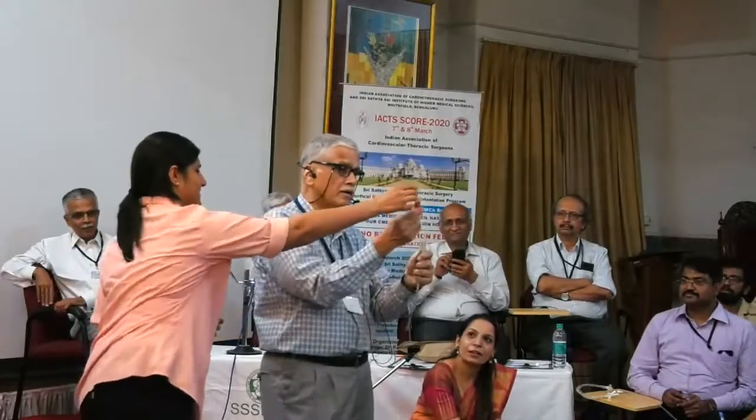Perfect. This cap is hemostatic. And this stylet is exactly the size of the opening in this red cap. So after passing the cannula, bring the stylet out till you are able to clamp it, and then you remove the entire cap. Okay? So this is extremely useful.